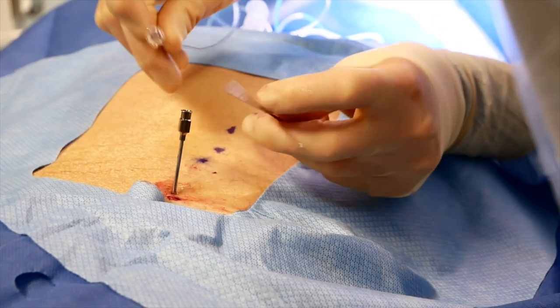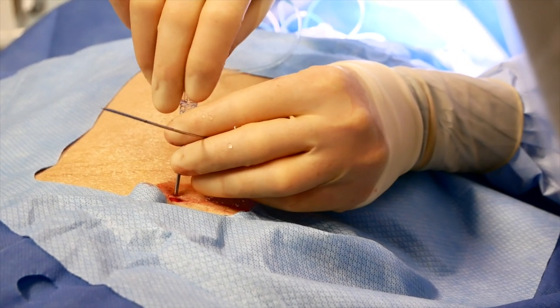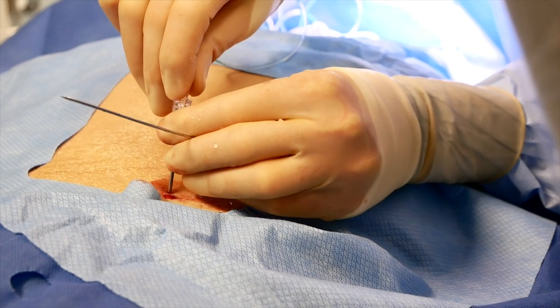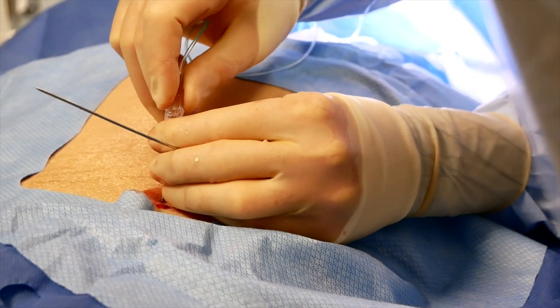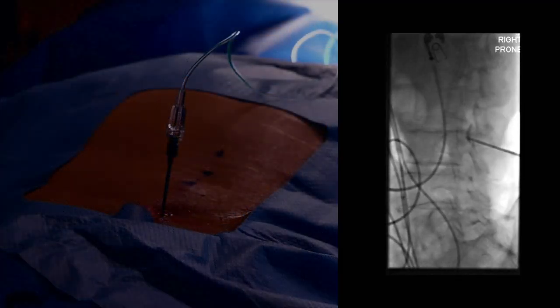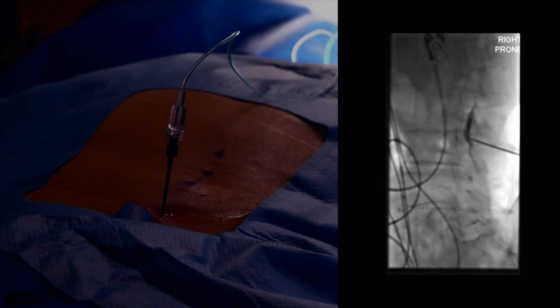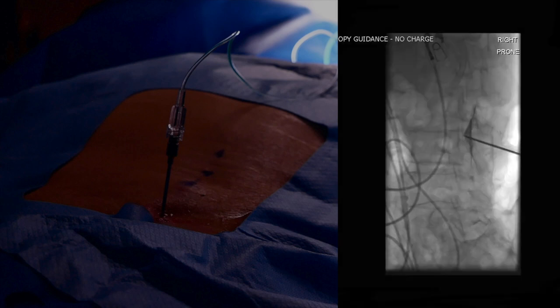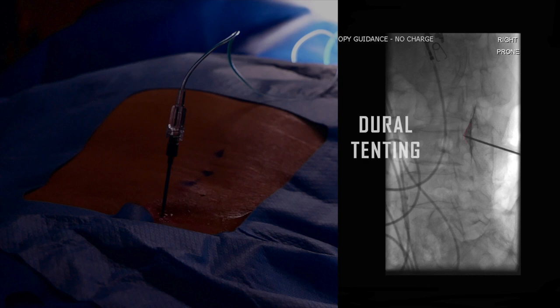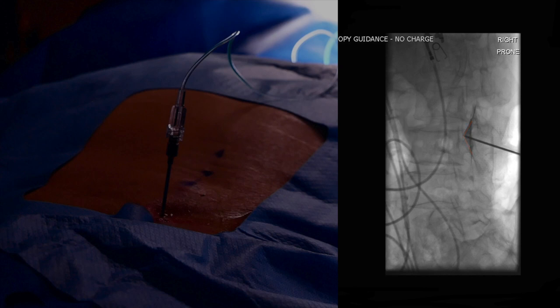Injection of contrast can also be helpful to identify the proper needle location. In this live film, the contrast is observed to spread into the epidural space, suggesting that proper intrathecal access has not been obtained. Tenting of the dura is also prominently displayed here, and in our experience is often seen in the prone position.